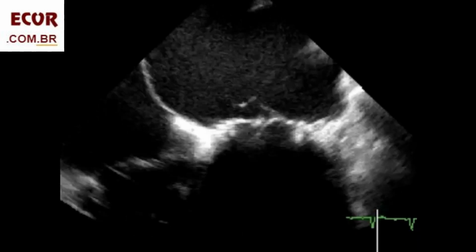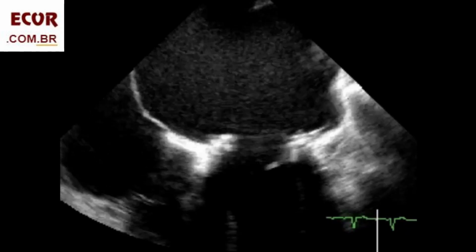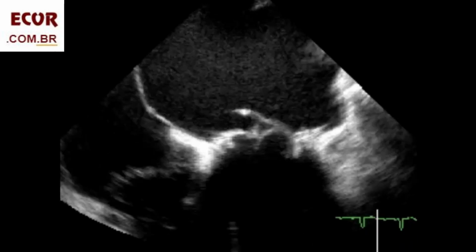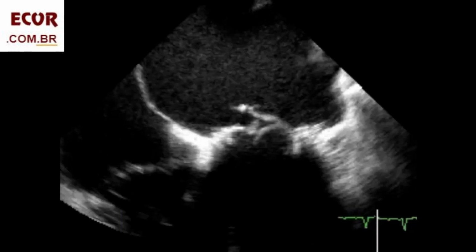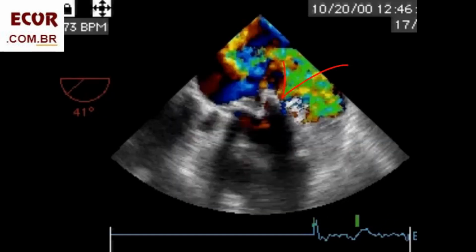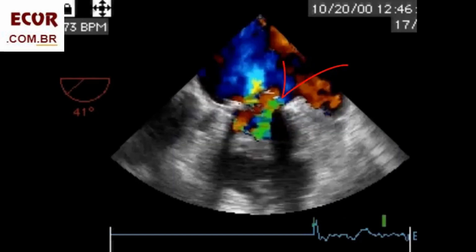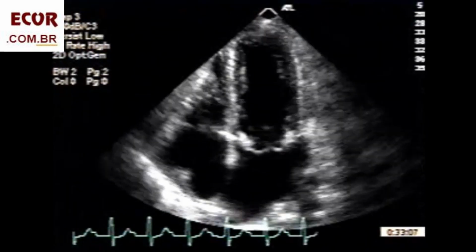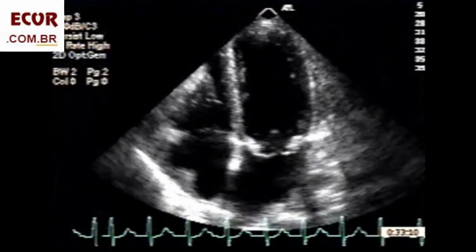Another example of a ruptured bioprosthesis. TEE makes it very easy to diagnose this case of rupture involving a leaflet. TEE showing a severe paravalvular regurgitation in a bioprosthesis. There is also a prosthetic regurgitation. Let's see these patients with a bioprosthetic mitral valve.